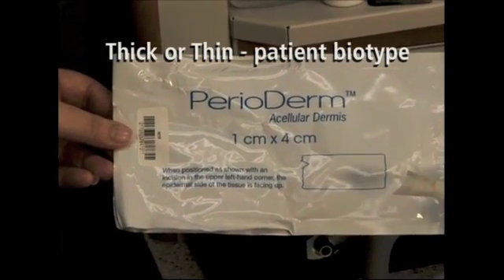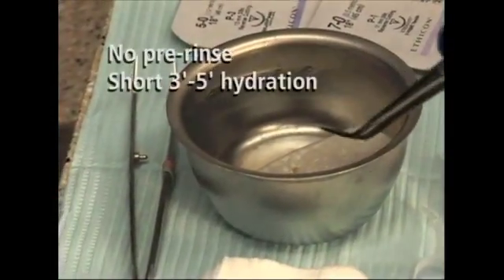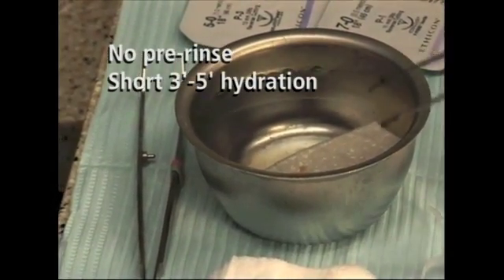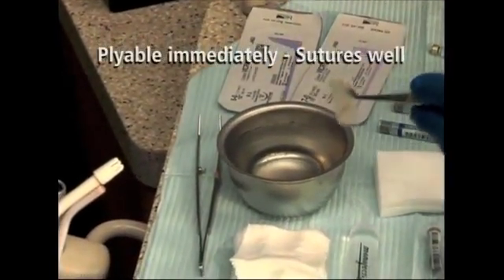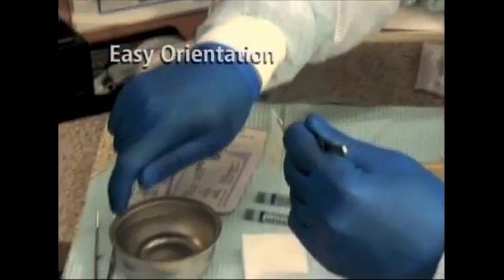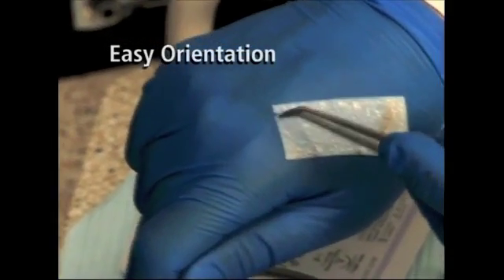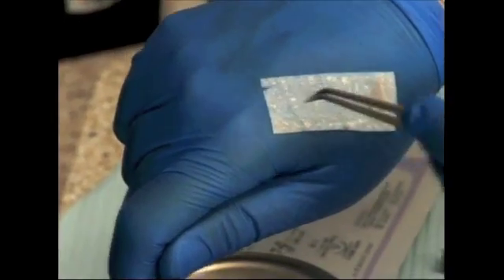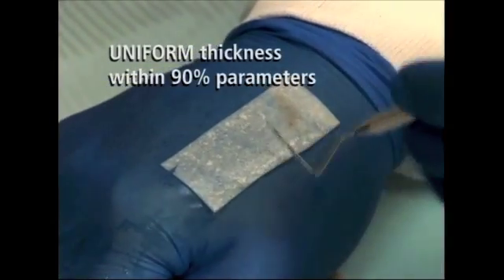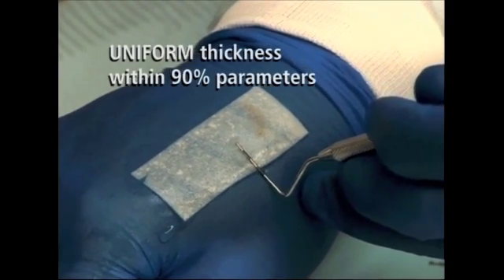Perioderm is an acellular dermal graft — in other words, it is human processed tissue. There are several benefits of perioderm over other similar products. My favorite is that it only requires a 3 to 5 minute hydration period, versus multiple washes and up to 40 minutes of hydration for other materials. Other benefits include the fact that it is not refrigerated and not soaked in antibiotics. Its thickness is also uniform and it comes in a variety of sizes. In addition, it has superior handling capability and is very easy to suture.